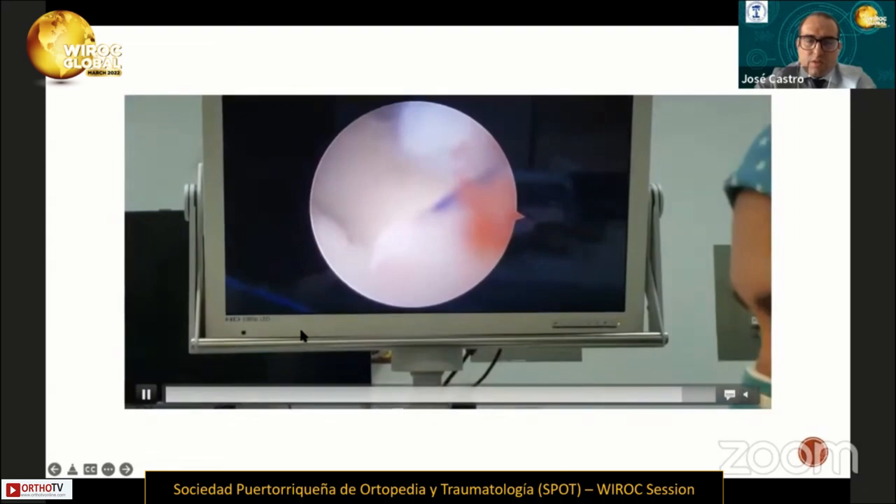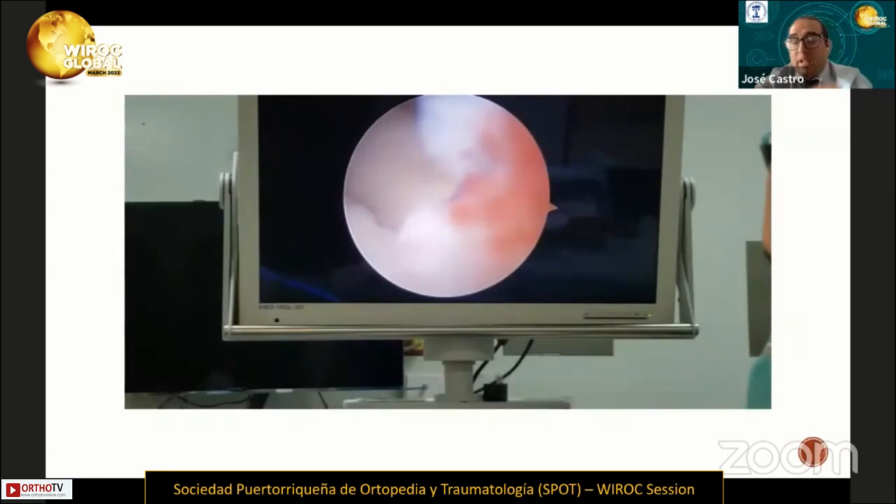After that, we performed the second knot between the proximal ends of the sutures. Finally, the patient was immobilized with a short cast for six weeks, and after that, he started physical therapy.